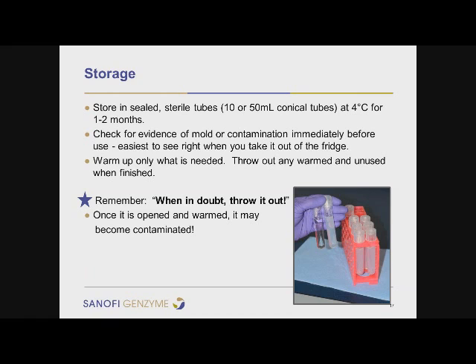Sometimes 50s, and I'll store them in the fridge for a month or two. So if you look down at the picture here on the left, you can see it's clear. That's a heated tube. On the right, you can see that solid opaque color. That's when the gel just comes out of the refrigerator. And so I usually check it for contamination when it is in that solid form because it's easier to see if there's any contamination there.